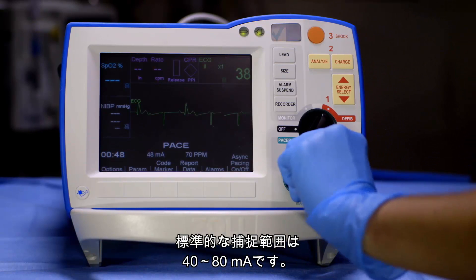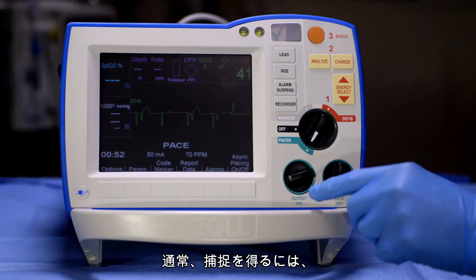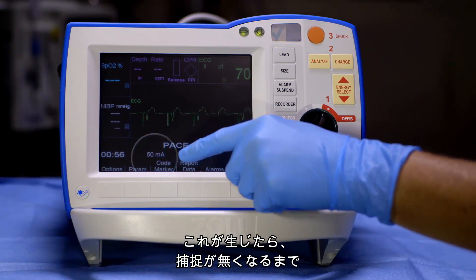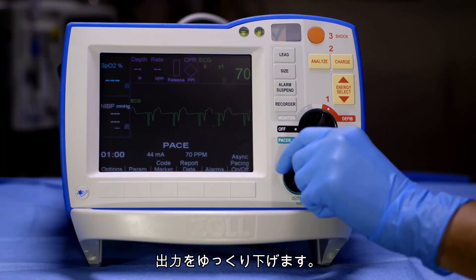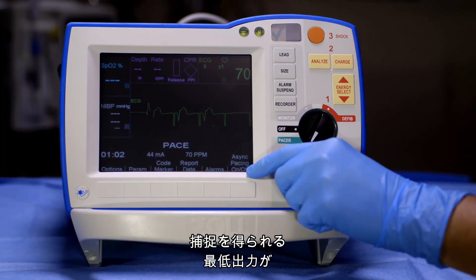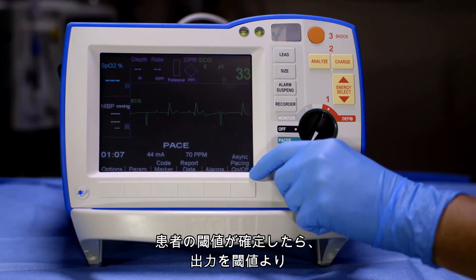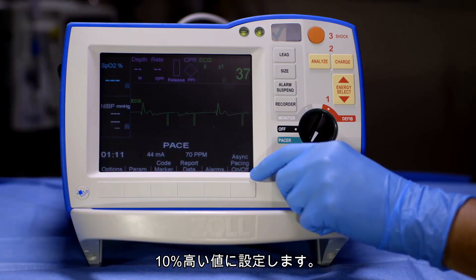Normal range for capture is between 40 and 80 milliamps. Usually, when obtaining capture, you will overshoot the patient's threshold. If this happens, decrease the output slowly until you just lose capture. The minimum output that obtains capture is the patient's threshold. Once you have determined the pacing threshold, set output to 10% above that.